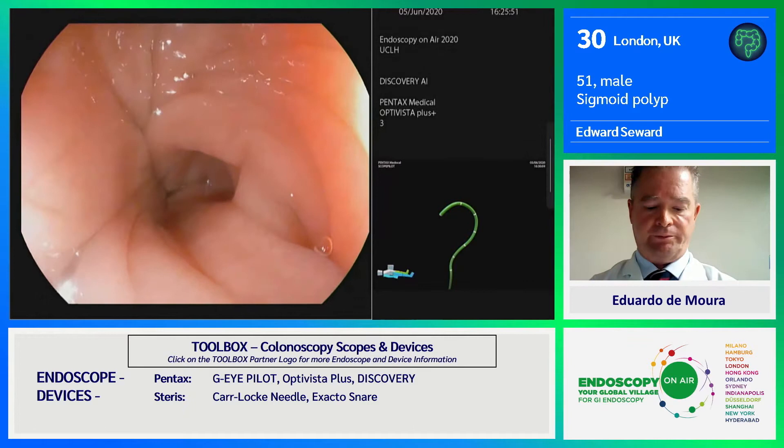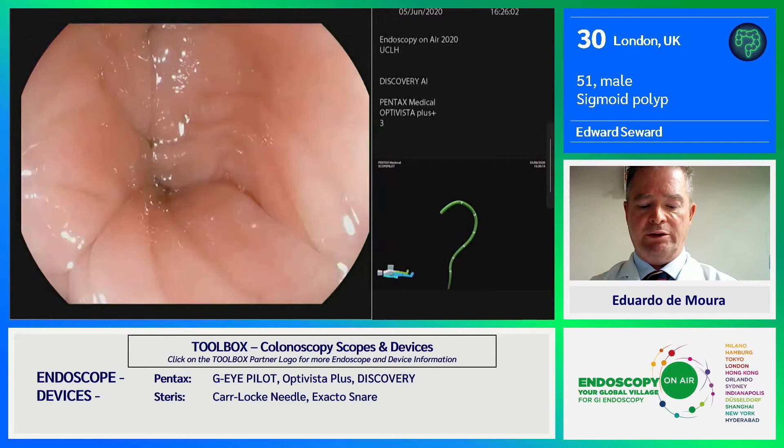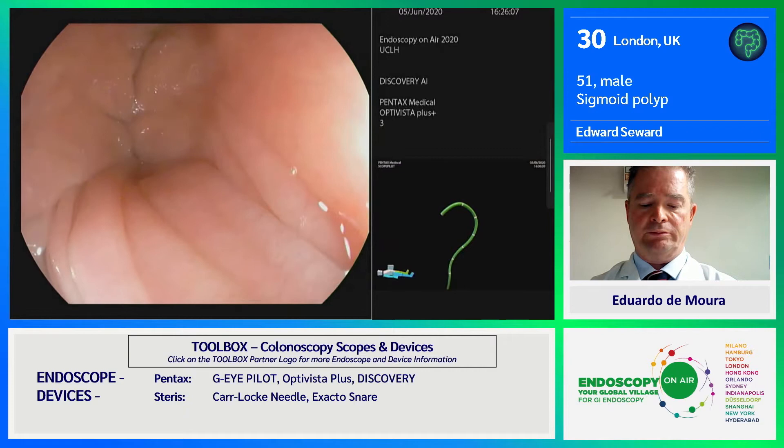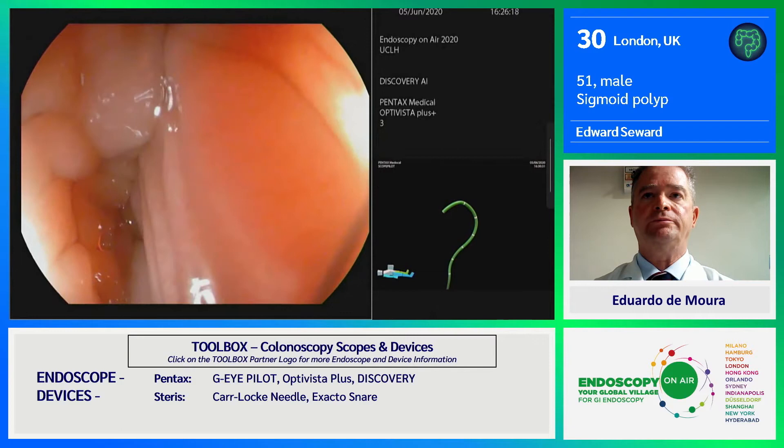So we're going in with a very exciting scope. This is the Pentax GI scope, and it's equipped with scope pilots, which is the image you can see on the bottom right of your screens — the green snake. That image is telling you that we're in about the mid-transverse at the moment. We've viewed the right-hand side of the colon and everything is normal.